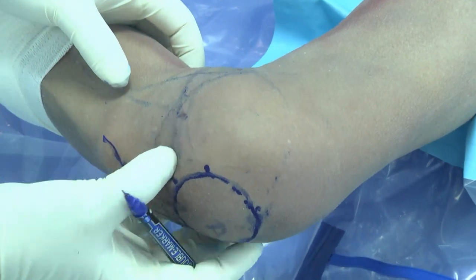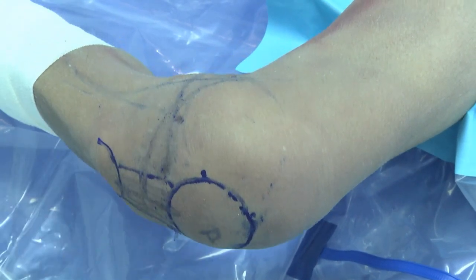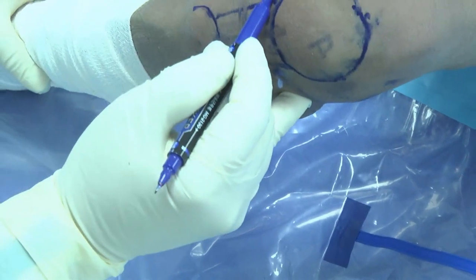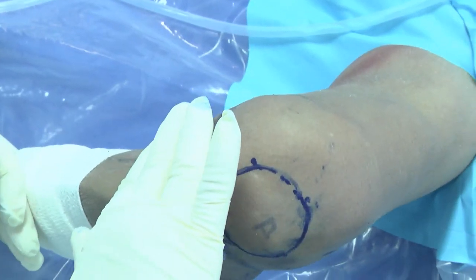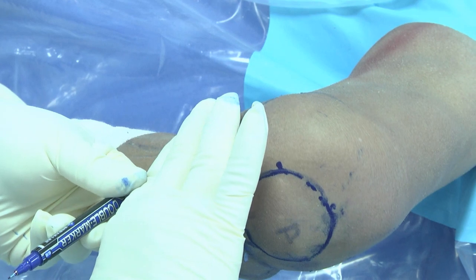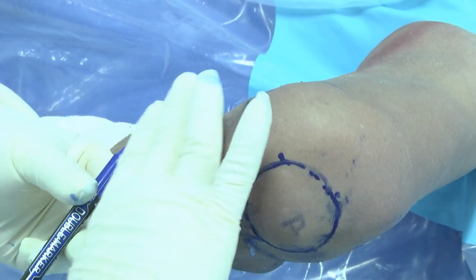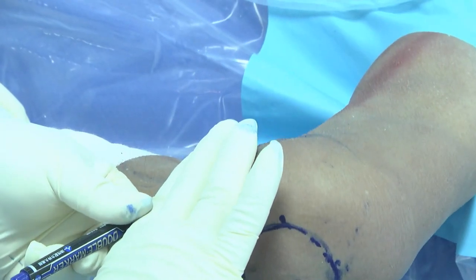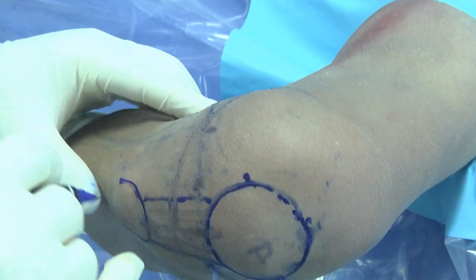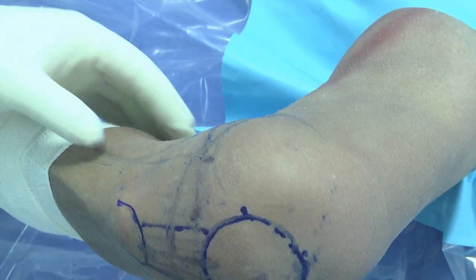To avoid saphenous nerve injury, two key points: first, the incision should be low; second, it should be transverse, not vertical. So our trick: this is the landmark of the knee joint. You go down about 3 finger breadths along the joint line. This is from a study by our teacher, Dr. Surapong. He found that with this 3 finger breadth, you will get the right position of your hamstring. The hamstring will be here.